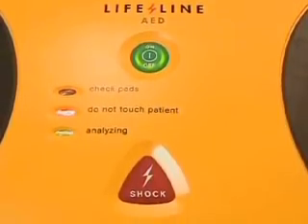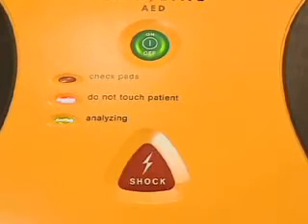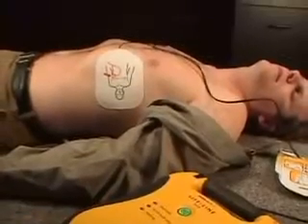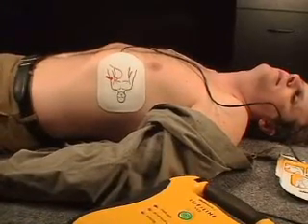If a shock is required, once the AED has fully charged, the shock button will flash and the AED will instruct you to press the shock button. Press the shock button to deliver a shock. Press flashing shock button. Shock 1 delivered. It is safe to touch the patient. Begin CPR now.